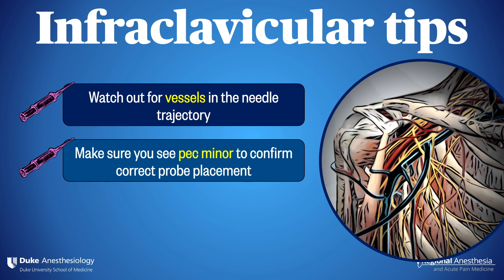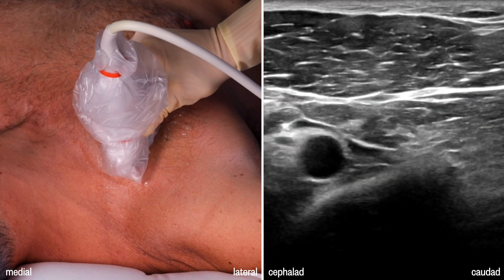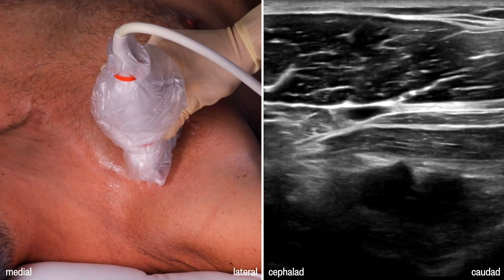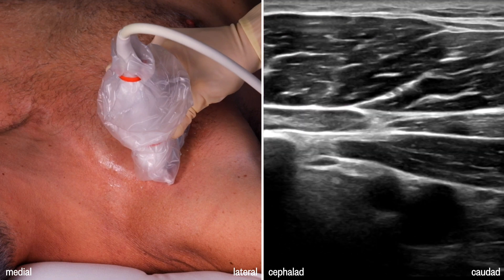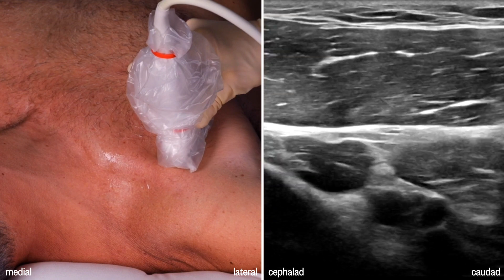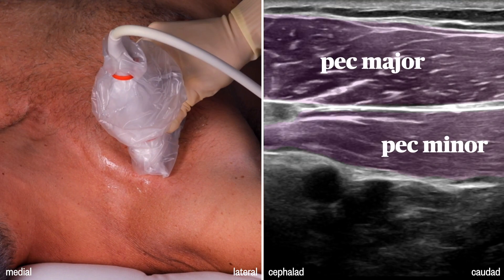Second, it's a common novice error to inadvertently let the probe slide medial or lateral, making it challenging to find your landmarks. As long as you keep the narrow pec minor muscle on the screen, you should be in good shape. When the probe slides medial, we lose pec minor and end up very close to the chest wall. Going the other way, we pass by our optimal view and end up losing the artery as we begin to see more deltoid and shoulder structures. Keeping both pec muscles on the screen anchors your image in the right place.